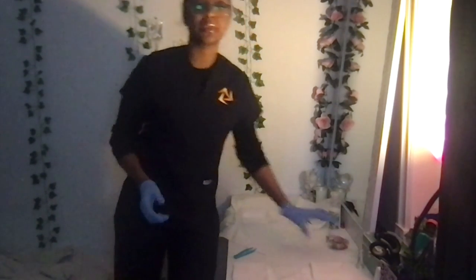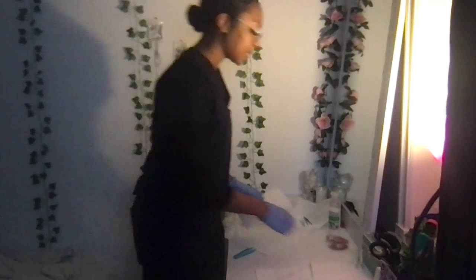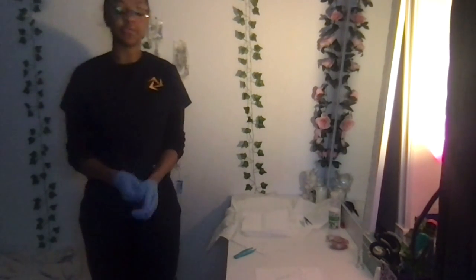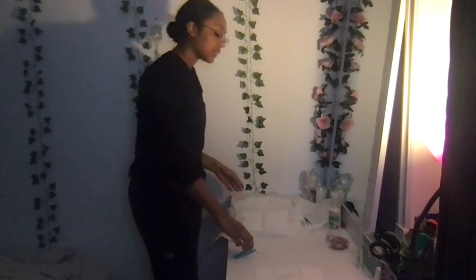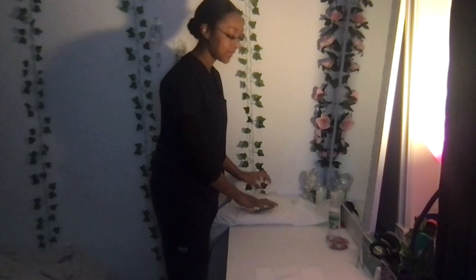Now that the aseptic procedure is done, then I can remove the drapes from the patient. Then I can remove my gloves, perform hand hygiene. Then I can help the patient into a comfortable position, lower the head of the bed and secure the side rails, and make sure that I clean everything up into the waste disposal. So everything in this kit I would dispose of and then put everything away and clean it up.